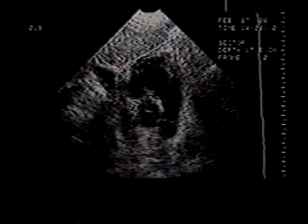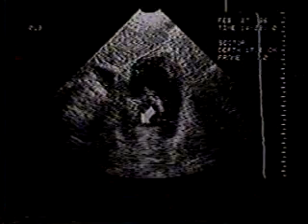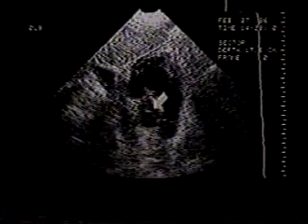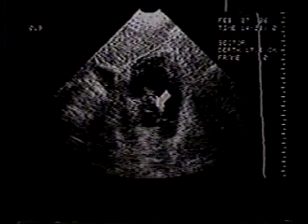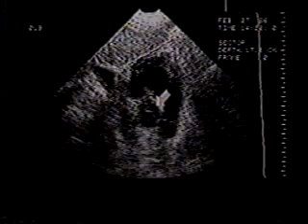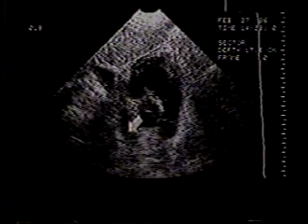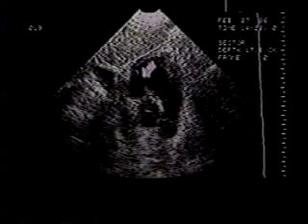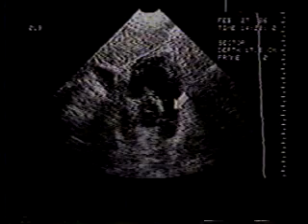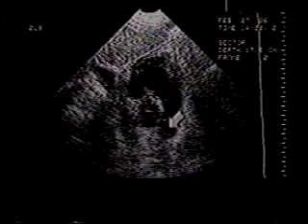We will now scan to the base of the heart. The aortic valve is immediately apparent in short axis. It is not usually as easy to identify the three aortic cusps from the subcostal position as it is from the parasternal. The left atrium is behind the aortic valve. Note the tricuspid valve leaflets and the right ventricular outflow tract, which leads to the pulmonary valve. Beyond the valve is the main pulmonary artery.